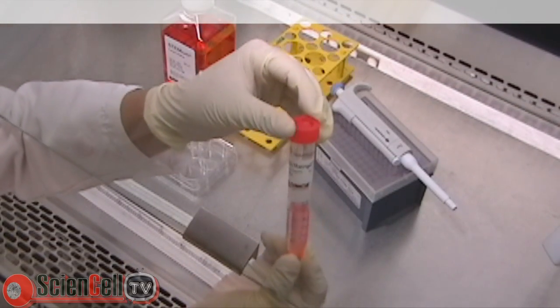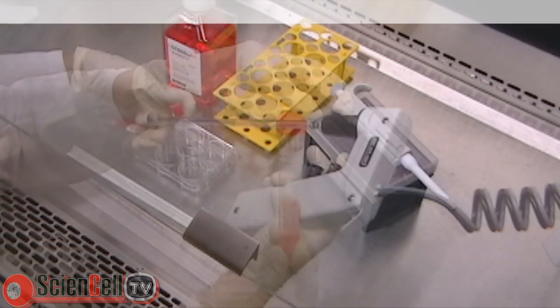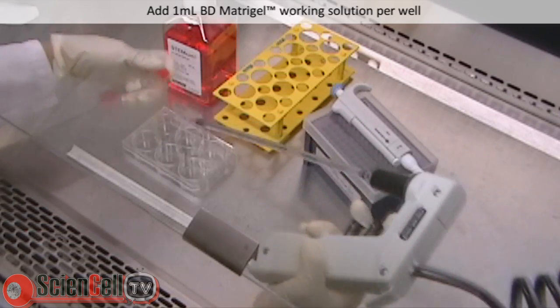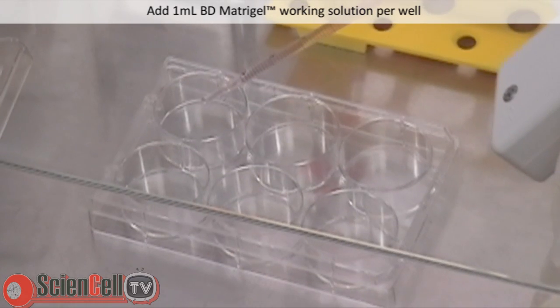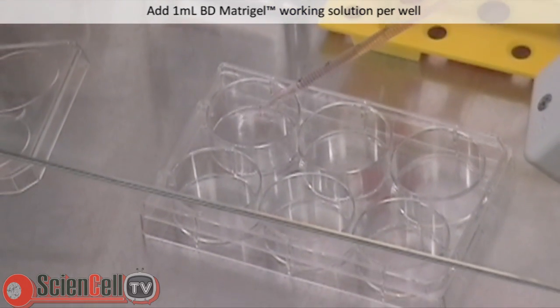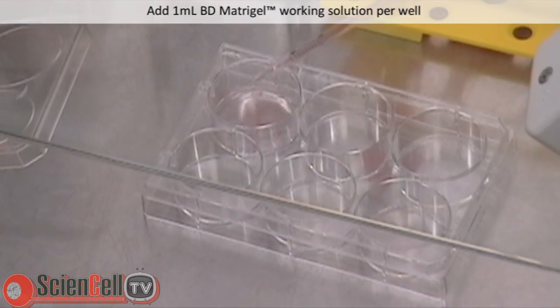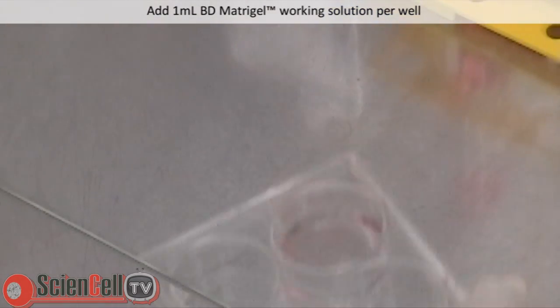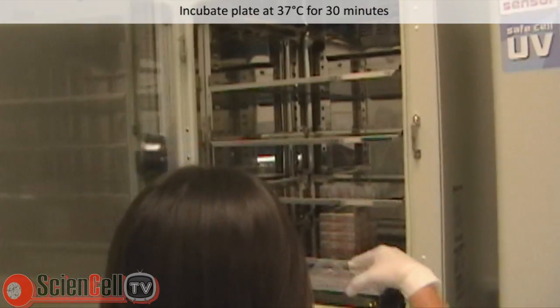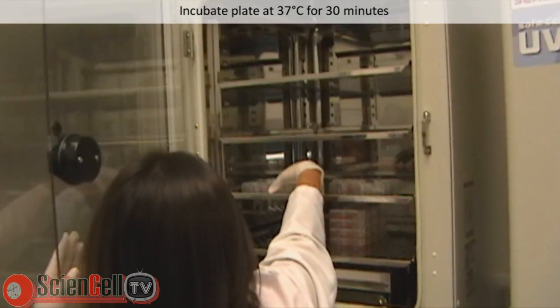Shown here is the prepared working solution of BD Matrigel. To coat the plate, pipette 1 mL of BD Matrigel working solution per well and distribute evenly. Incubate the plate at 37 degrees Celsius for 30 minutes.